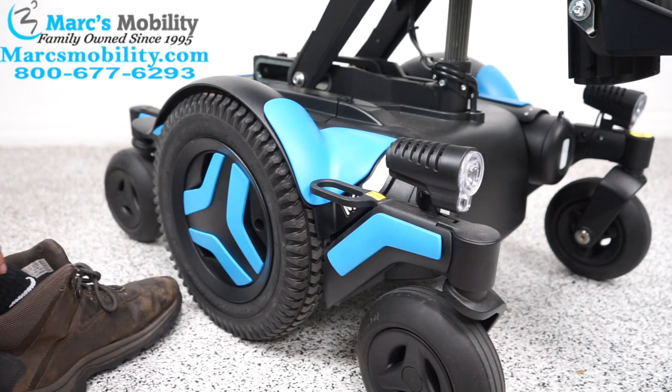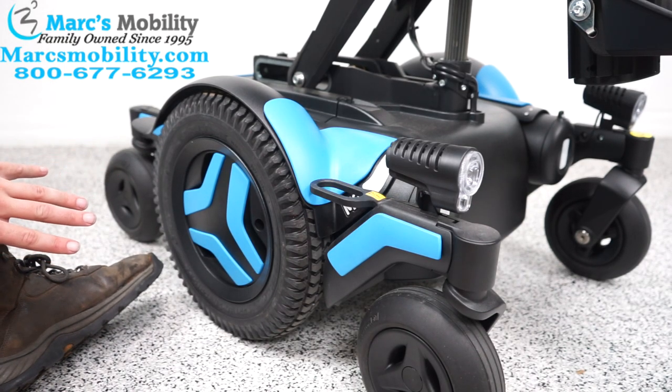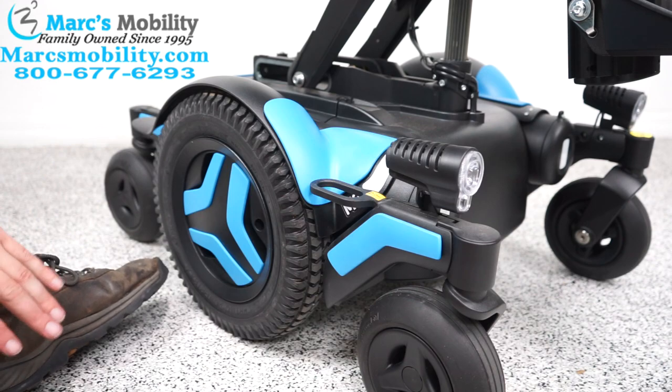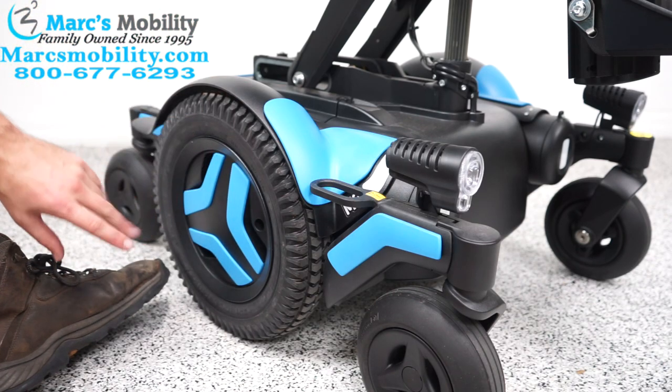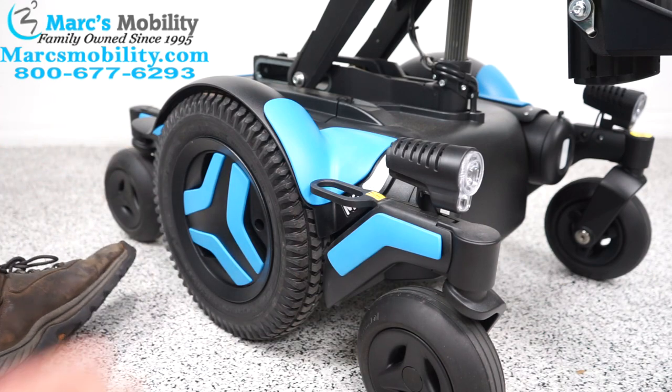Today I'm going to go over how to change the shrouds on a Permabil power chair. This is going to be for the newer style — this does not apply to the older style, that will be a little different. I'm using an M3. The M5 will also be about the same, and the F3 will have different shaped shrouds, but the concept will also be the same.